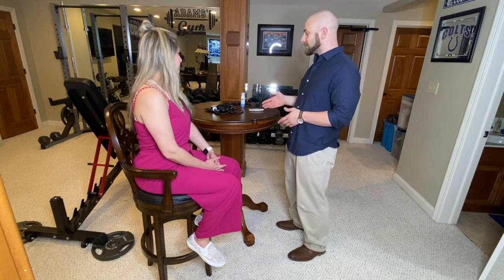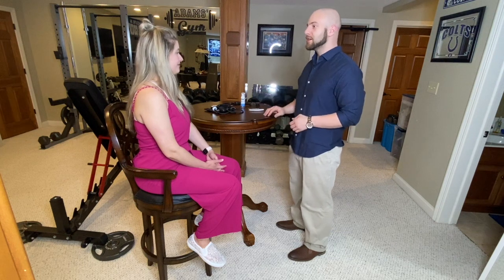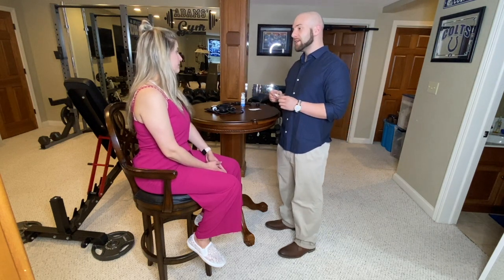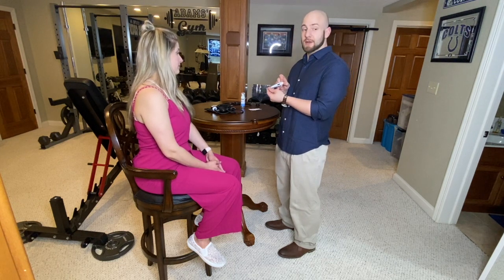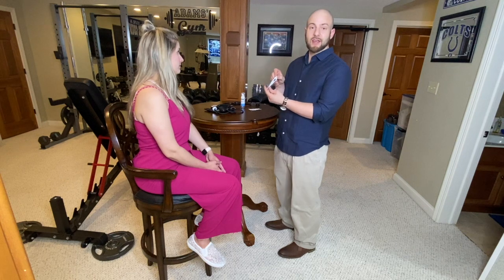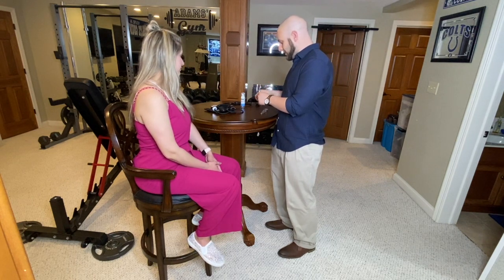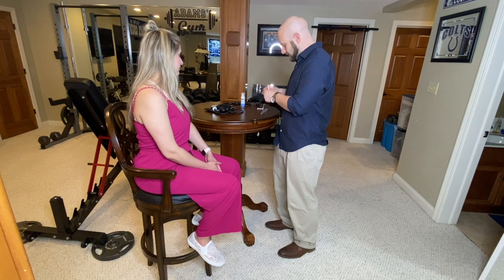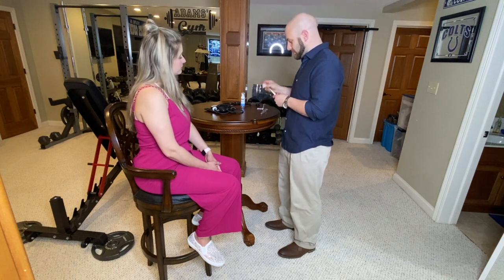Lindsay, I'm going to go ahead and get your vital signs today, and that'll take about 10 minutes. Do you have 10 minutes to spare? Okay, wonderful. First, Lindsay, have you eaten or drank anything in the last 30 minutes? No? Okay. Well, first I'll start off by getting her temperature today, and I'm going to do that with this temperature gauge. I will take it out of the container it comes in and wipe it down with an alcohol pad. I'll be wiping it down with an alcohol pad before and after use.